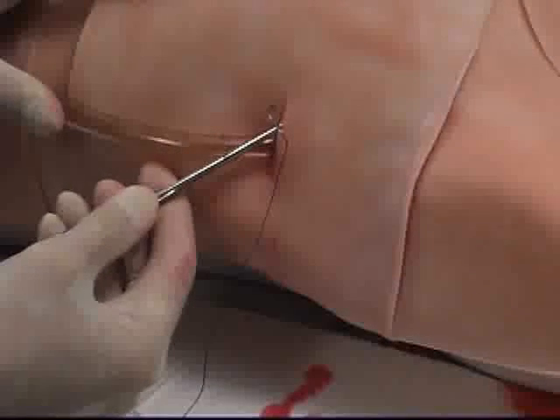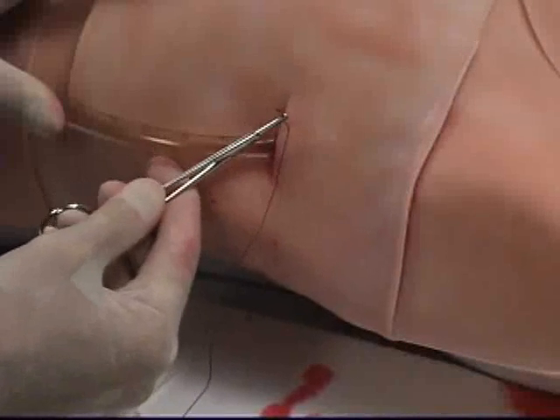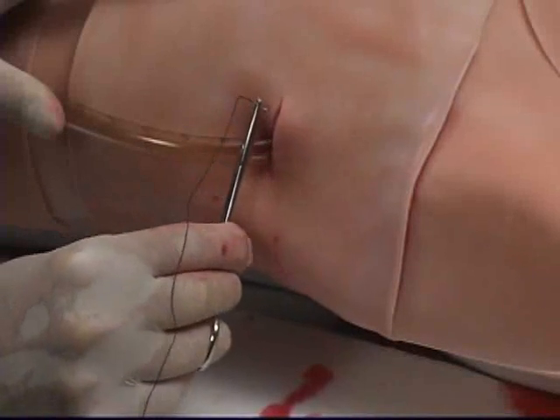The skin is designed to feel like live tissue when sutured, allowing the student to suture the tube into place.